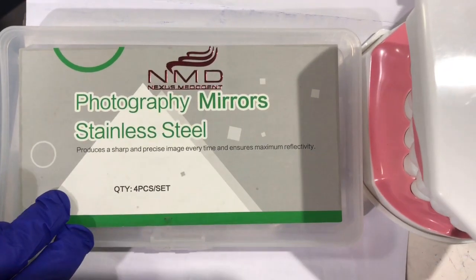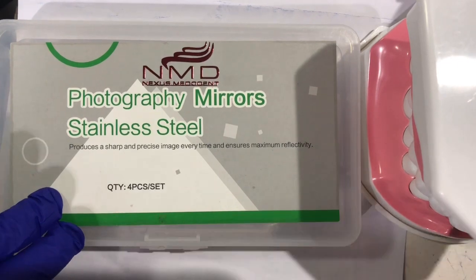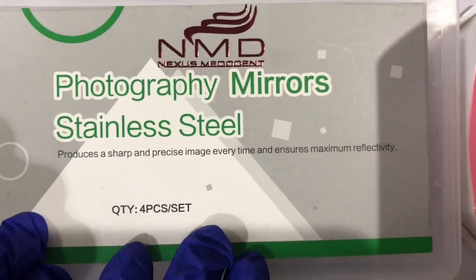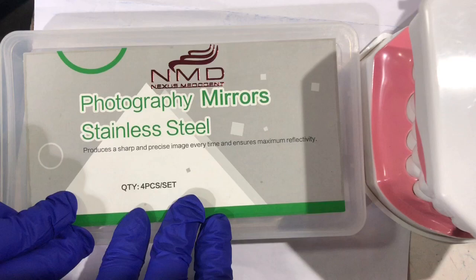Hello friends, back again with new stuff. This is the photography mirror stainless steel from NMD Nexus Mirror. It is basically made up of high-grade non-magnetic stainless steel and is ideally used in photography of dental cases.